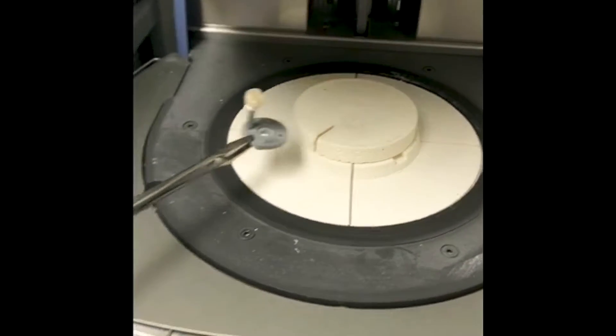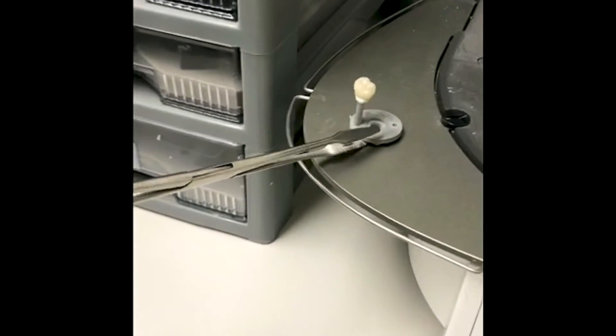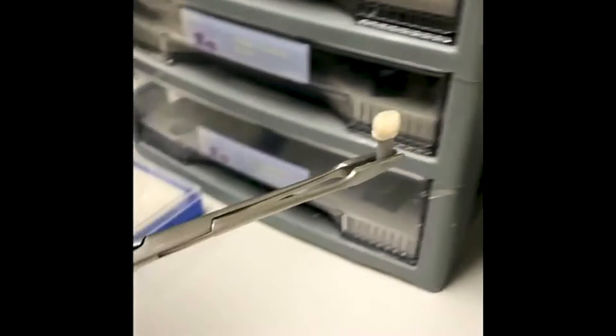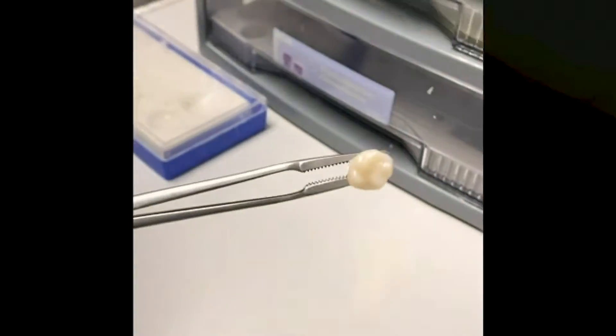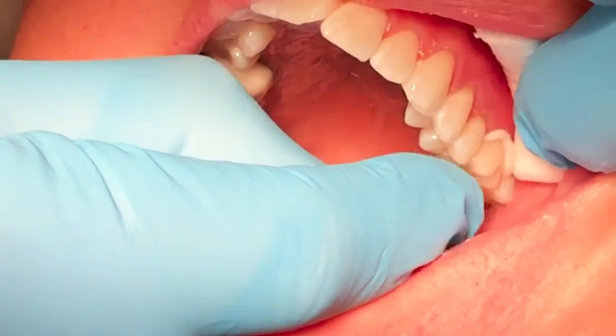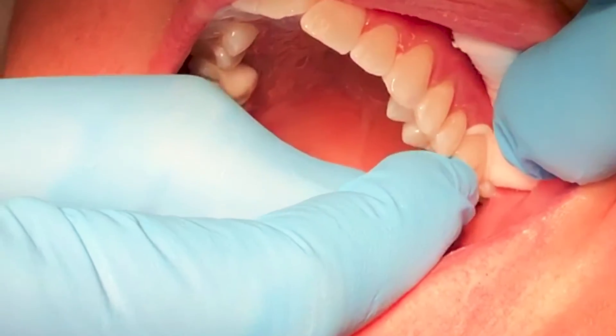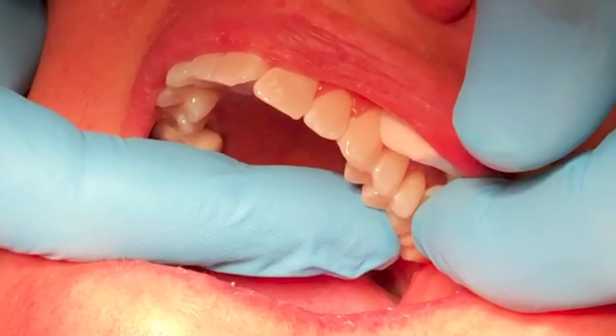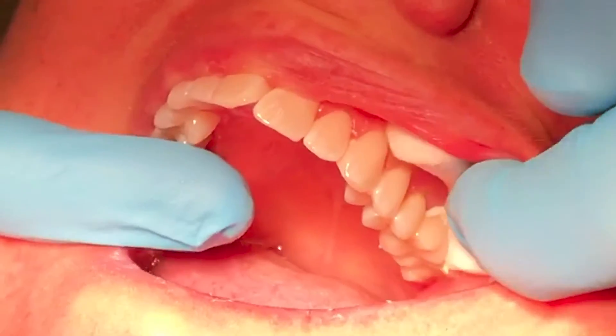Baking will make it smooth, shiny, and glazed. When it's ready we'll take it out of the oven — you can see now it's its proper color, it's white, it's ready to go. We'll clean it up a little bit and get ready to put it in the mouth. Here we're inserting the tooth with some special cement, and after setting a few minutes we'll clean it up and the process is complete.